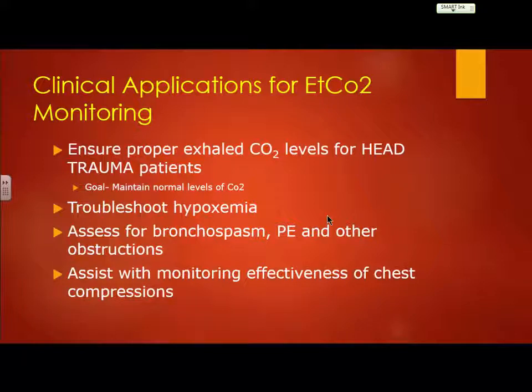Yeah. And this is kind of an introduction. We're going to actually throw some waveforms up here in just a minute for you to put it together. But yes, ma'am. Isn't that indicator of an asthma attack, like a nail in the coffin kind of, this is an asthma attack? Yeah, especially if you've got other clinical symptoms that are going along with that.